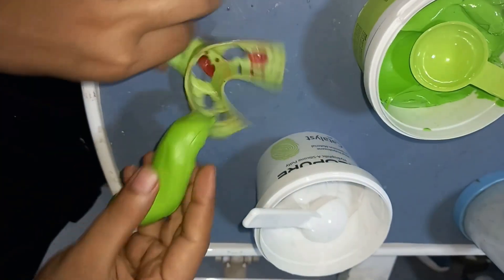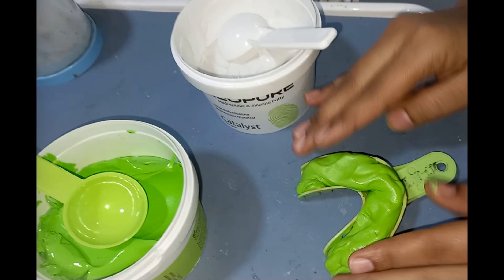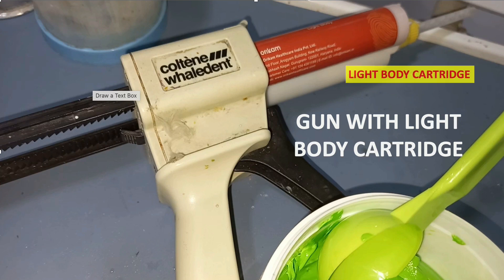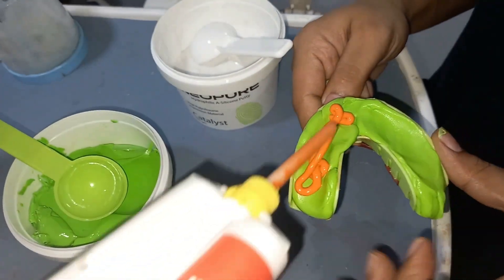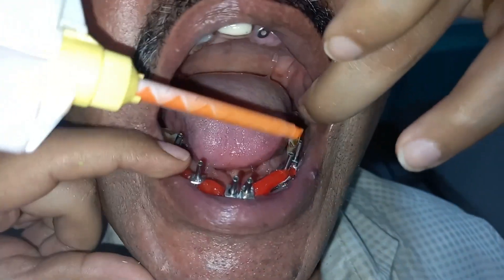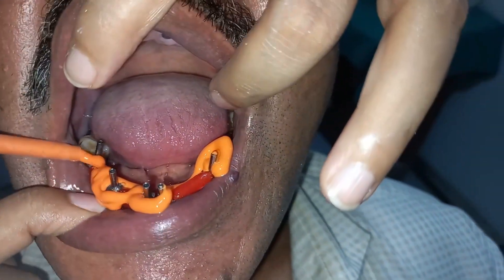Then load the putty onto the stock tray. After loading the putty on the stock tray, we are going to use a light body over it. As you can see in the figure, we have a gun with the light body cartridge. When we click the gun, the light body comes out from the mixing tip — it is automatically dispensed and mixed as it exits. We apply the light body onto the tray.